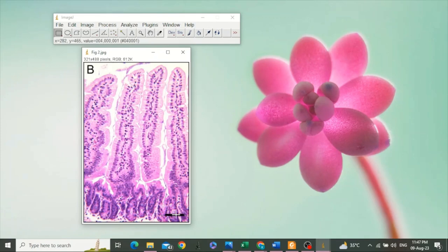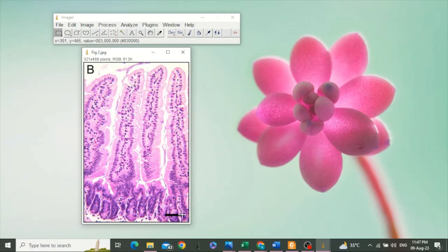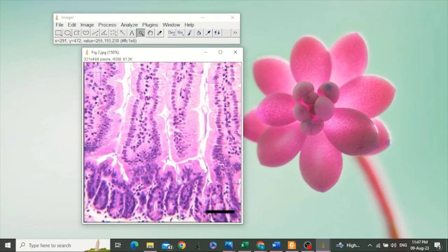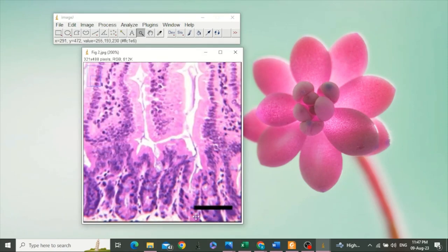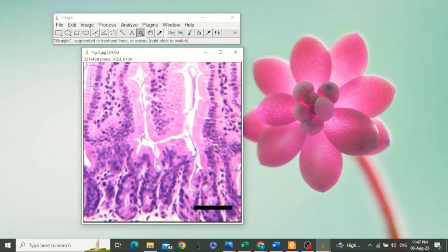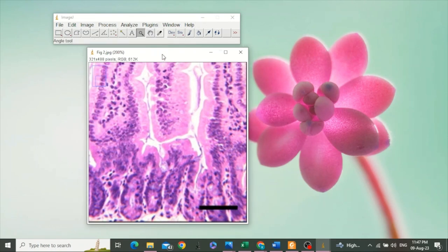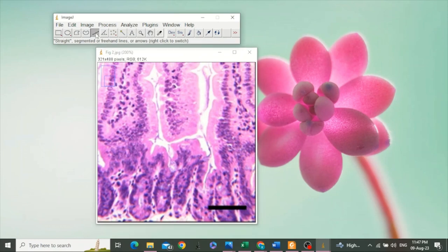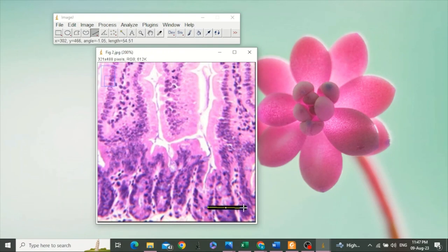For this purpose, select this tool, the straight line tool. You can also magnify it before selecting that tool if the scale bar is too small. Okay, select this tool and draw a line on the scale bar. The line should be a straight one.